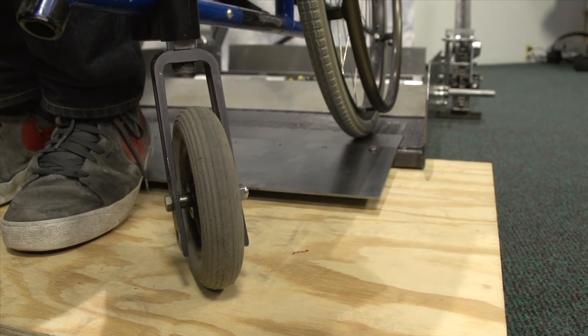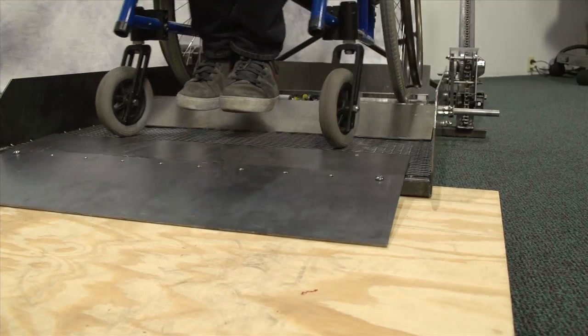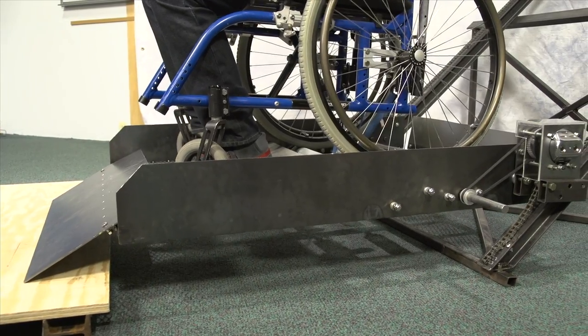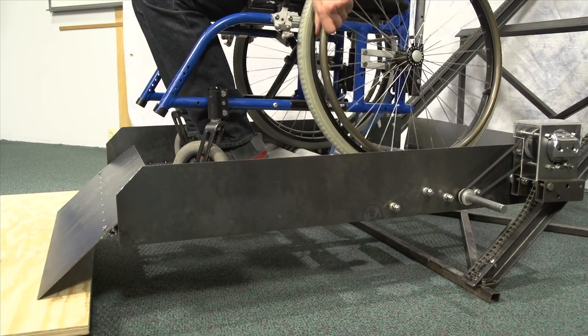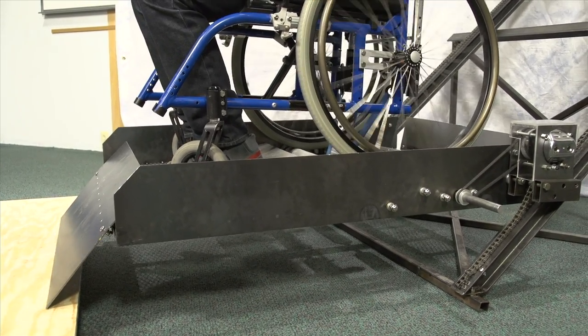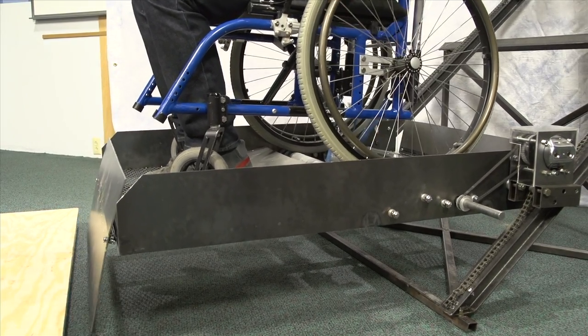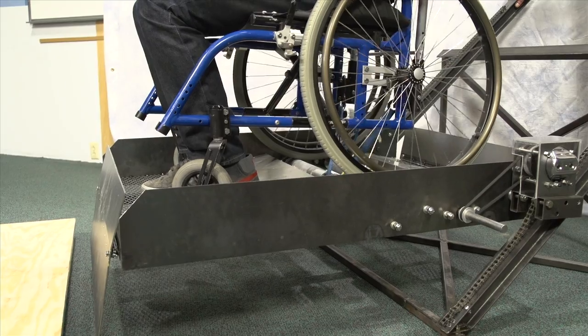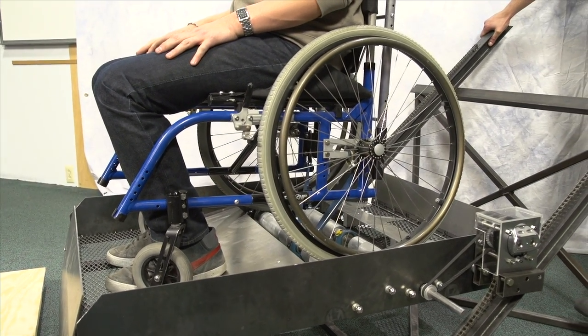Here we can see the funicular in use. The front safety gate serves initially as the entrance ramp for the user. Once the platform is raised off the ground, you can see the gravity operated gate going into its safety position. Due to the installed braking system, the user can stop at any time and the platform will stay in place. Also, if the user stops in mid-ascent or mid-descent, they will not perceive any backlash or falling.